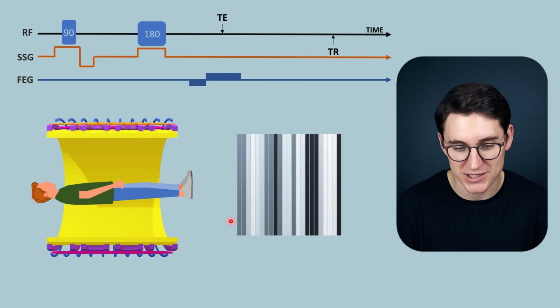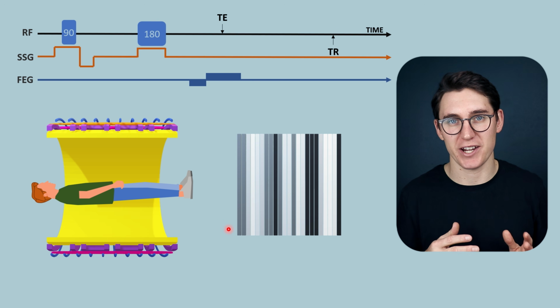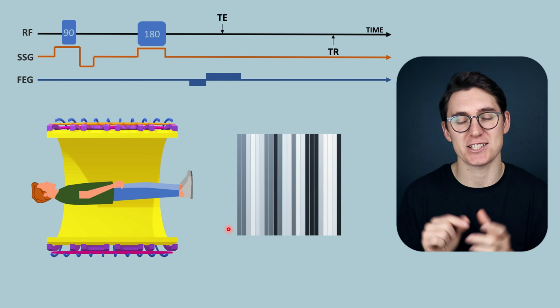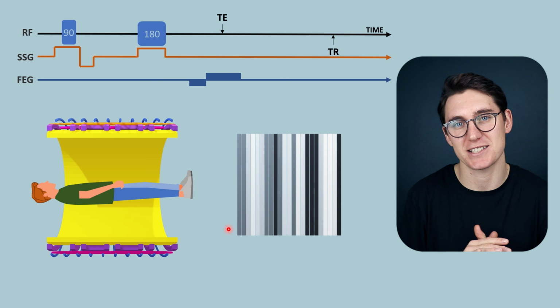The same thing happens if we were to get values of all our rows here. Now it's the same as taking a frontal chest x-ray and a lateral chest x-ray and saying from just those two data points we are going to create a single slice on a CT image. There's simply not enough data to get all of those pixels that we require for an entire slice.